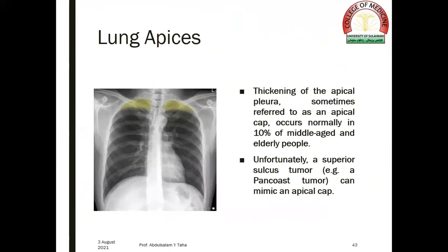The lung apices: thickening of the apical pleura, sometimes referred to as an apical cap, occurs normally in 10% of middle-aged and elderly people. Unfortunately, a superior sulcus tumor — for example, a Pancoast tumor — can mimic an apical cap.